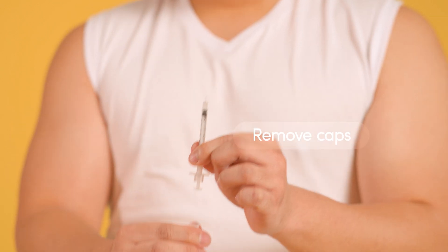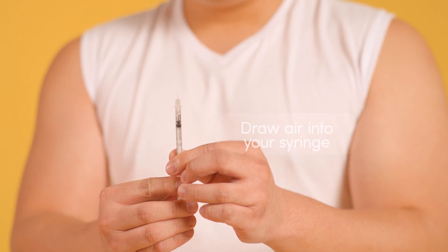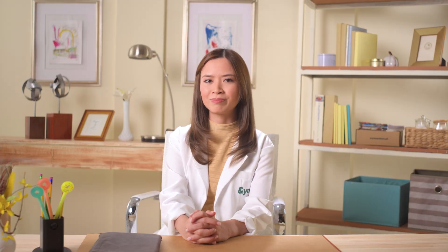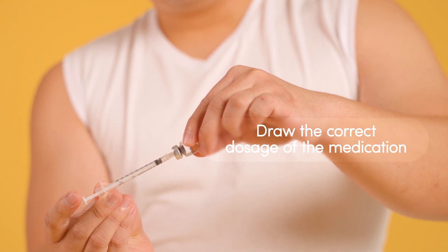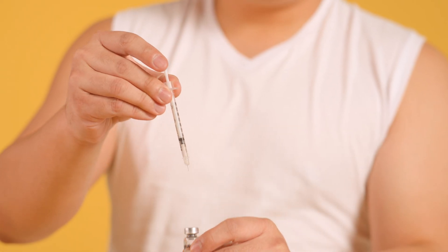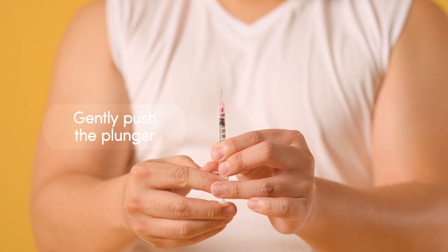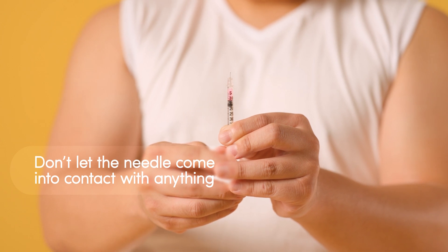Make sure the area is clean. Remove the protective cap from the end of the syringe. Pull back the plunger to draw air into your syringe, matching the volume of your prescribed medication. Puncture the top of the vial with the needle and push the air in — this breaks the vacuum seal, allowing you to withdraw the medication easily. Invert the vial and slowly pull the plunger back, drawing the medication to the correct dosage. Carefully remove the needle from the vial. Gently tap or flick the syringe to bring any air bubbles to the top, then slowly push the plunger to remove them. You might need to adjust the plunger slightly to reach the precise dose. Once your injection is ready, avoid touching the needle tip or letting it contact any surface.